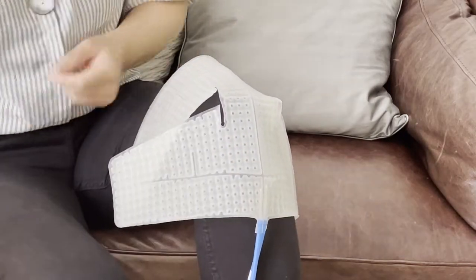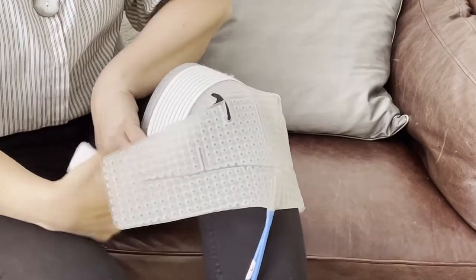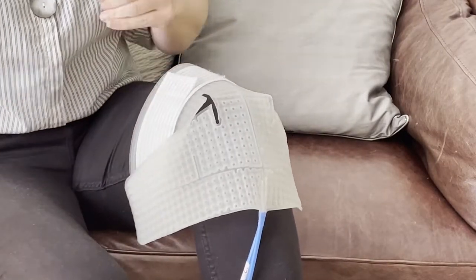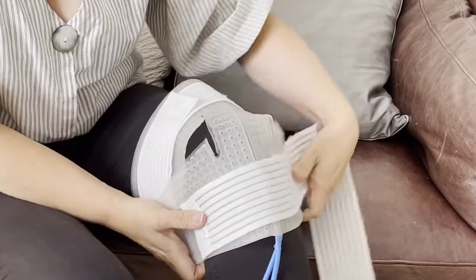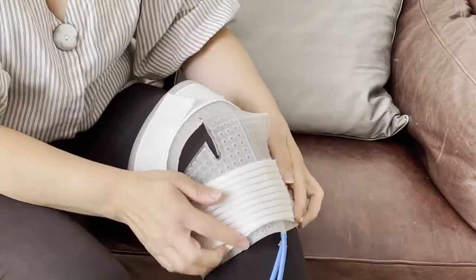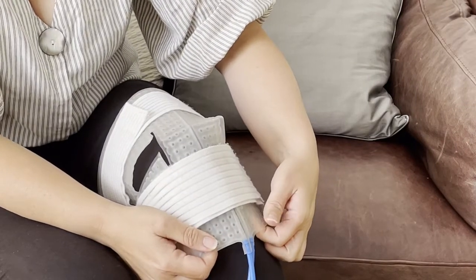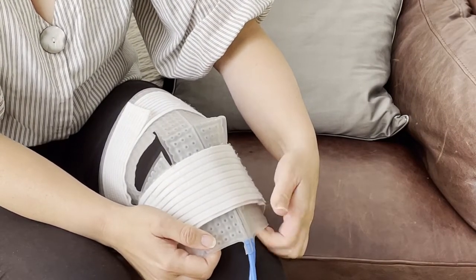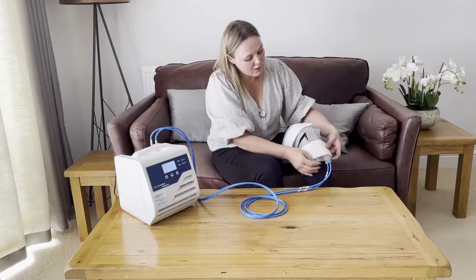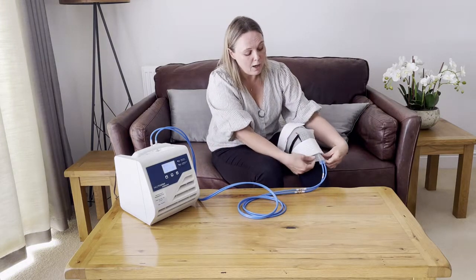You have long Hylofix straps which are velcro straps. The key with these is making sure you are not attaching them too tightly — you just want to wrap them round to hold the cuff in place. One strap goes above the kneecap and one goes below the kneecap. Just make sure there are no kinks and apply the strapping; it doesn't need to be too tight.